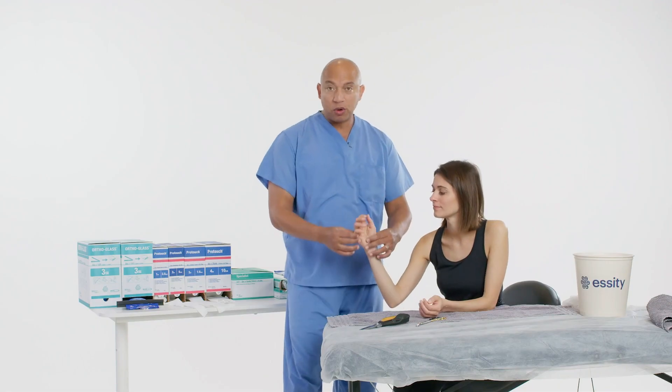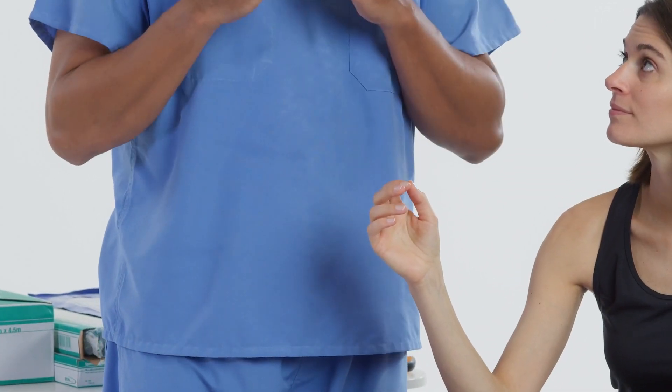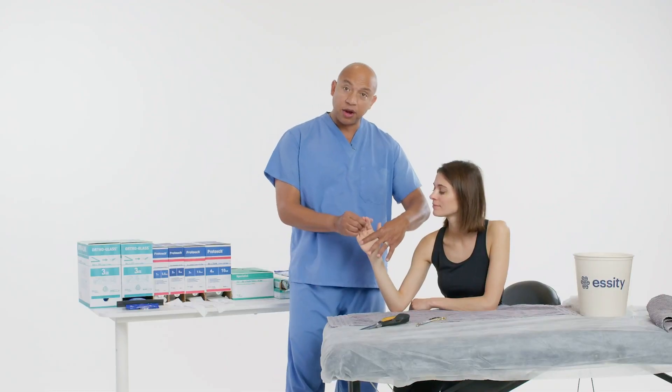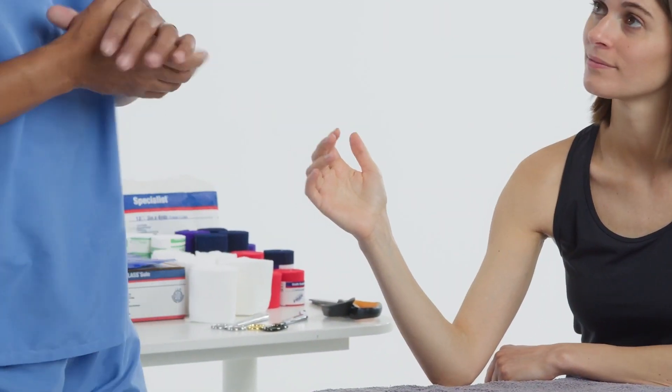It's imperative that you let the patient know what we're going to be doing, because they will not be able to take it off — especially if they want to shower or what have you. It has to be covered. So we're going to stop it here at the distal palmar crease. Let's measure first and take care of everything.